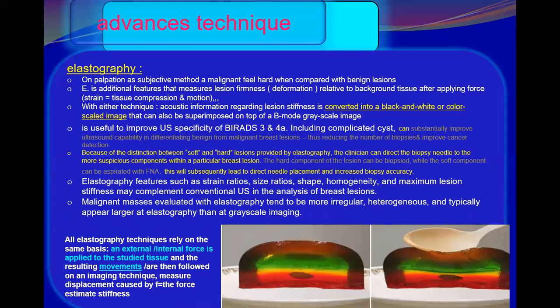And there are also other features for interpretation of the elastography regarding strain ratio, size ratio, shape, homogeneity, and as you mentioned, the maximum stiffness.